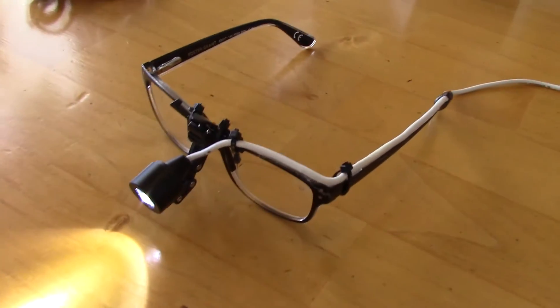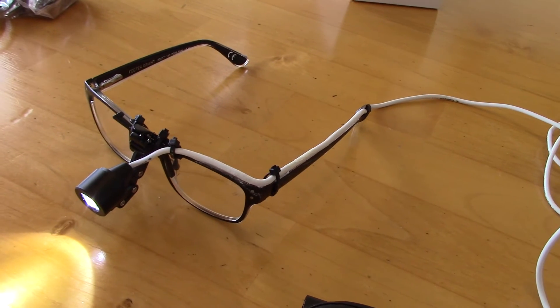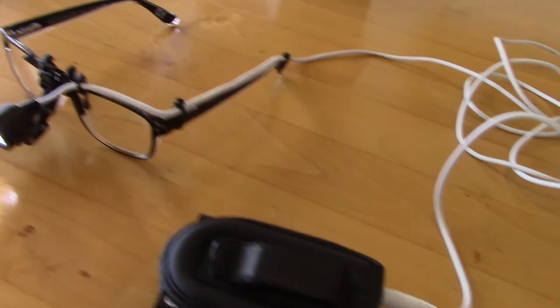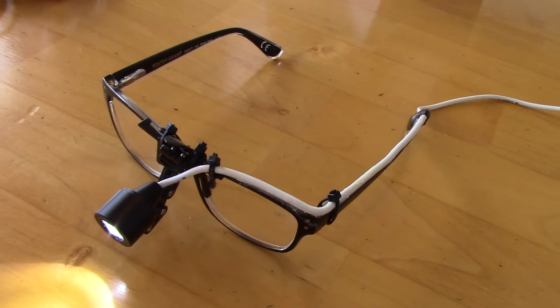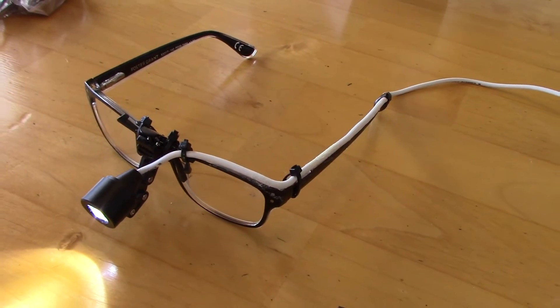This light is not only good for surgery, operations, and dental work — it's also useful for jewelers, watchmakers, and anyone who requires good lighting for close-up work.